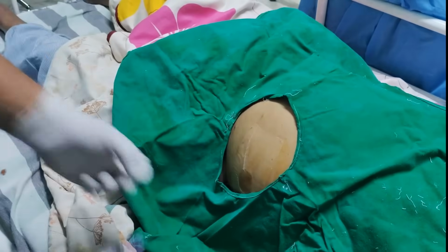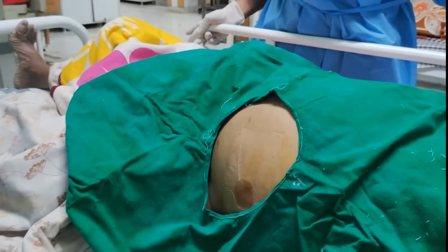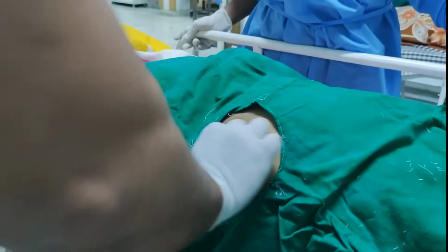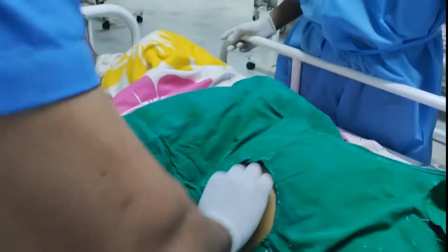Once you have anesthetized the area properly, proceed further. Apply pressure on the anesthetized area and rub it until the anesthetic dissolves. Please follow all aseptic precautions.